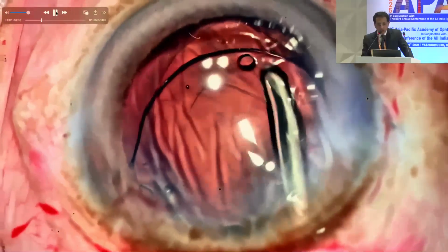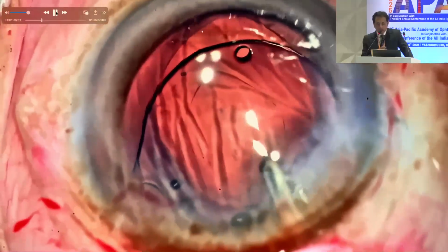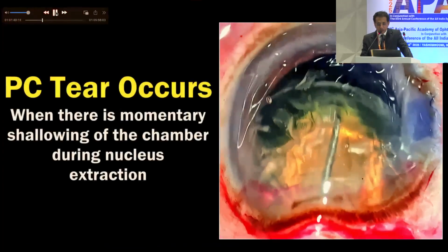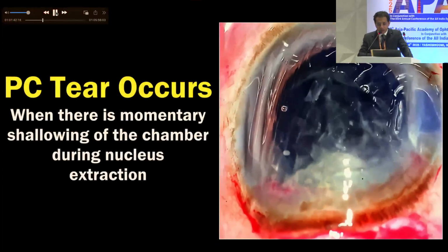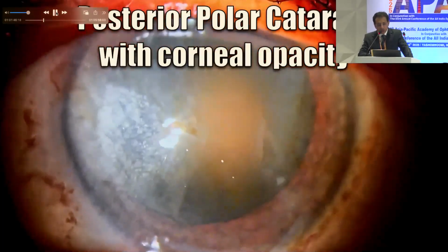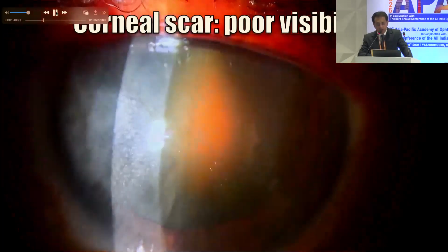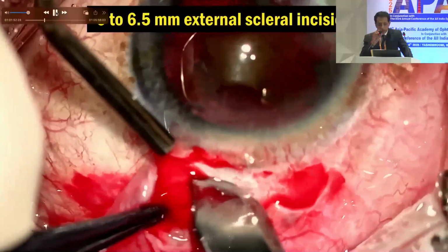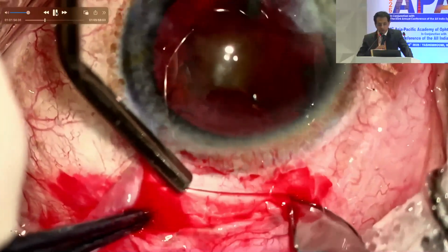So now my question was, can we prevent this posterior capsular tear in these PPC cataracts? Because this was the step in which it actually happened, that momentary shallowing. So how can we prevent this? This is another dense cataract with a posterior polar cataract, and there's a reason why I chose to do a manual SICS over phacoemulsification.